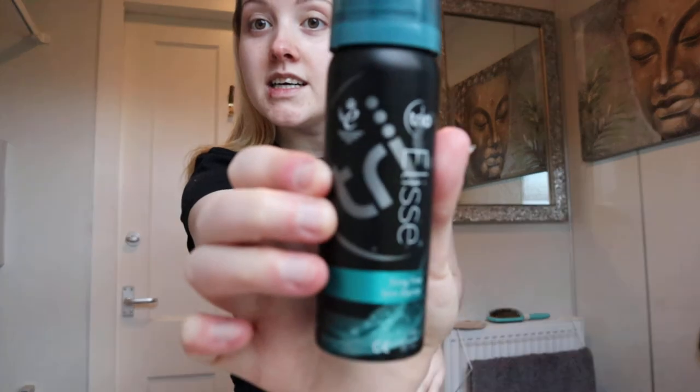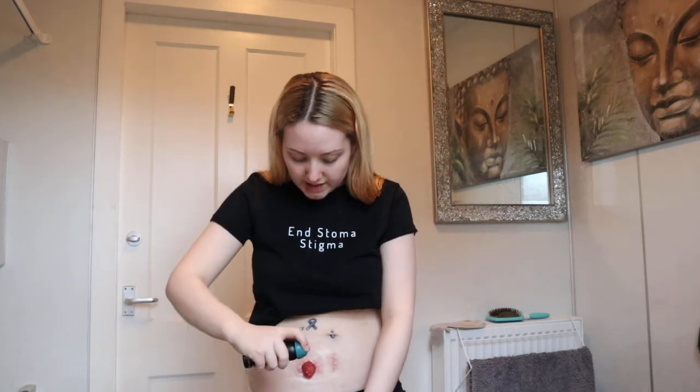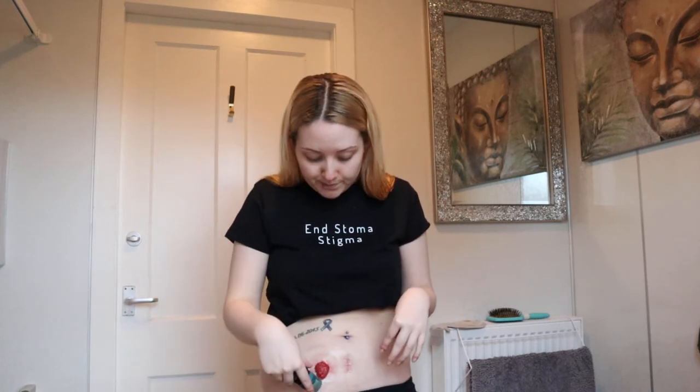Now this is my favourite product. This is the Trio Elisse Sting Free Skin Barrier Spray. It is amazing — literally the best barrier spray I've ever used. I've used quite a few over the years. I've had my stoma for about five years this June. What you want to do is spray it around the area where the bag will stick. Now if you use flange extenders, which are also known as half-moon stickers, then you want to spray a little bit more around the edges where those are going to stick, just to protect the skin.